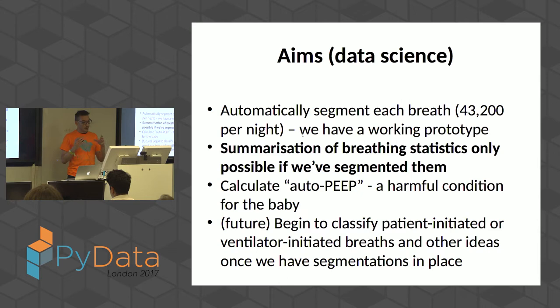One which we're about to start work on is this idea of auto-PEEP. Auto-PEEP: a baby breathes in, their lung inflates, they have oxygen or gas in their lungs. They breathe out, the gas leaves their lungs, but then before it's fully expired, the ventilator starts pushing more air in, so they haven't fully deflated. Then they breathe again, they expire, and then they don't fully evacuate their lungs. And so leaving this positive pressure residual at the end of the breathing cycle can cause tissue damage, and so that's a bad thing for the baby.